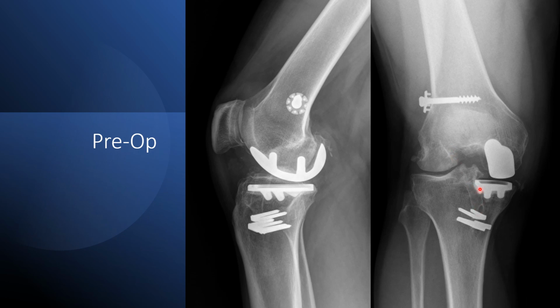So ACL, and then went on to develop medial compartment arthritis at a later date and had a secondary partial knee replacement. So this patient has had a long history of post-traumatic change, first starting with a blown out ACL with a subsequent repair, then went on to develop post-traumatic arthritis in the medial compartment and had a partial. But now, even later, is developing opposite compartment degeneration. We can see the lateral start wearing out with some subluxation to the side.